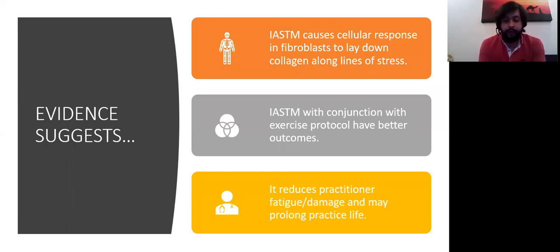If you switch from basic myofascial therapy to instrument assisted myofascial therapy, you will see that the amount of fatigue is very less. The damage to your thumbs, to your fingers, to other parts of the body is less. The effectiveness of the treatment will increase. You might show something different to the patient, that this is what special I'm doing for you. It is helpful in many, many ways.